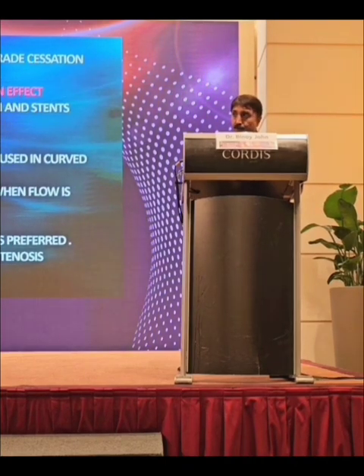accordion effect. There can be pseudo kinks, and sometimes kink transfer can also occur when you use the wires. This makes visualization and positioning of balloons and stents difficult. Coming to stent length selection, long stents are easy to use, but the problem is fresh kinks or pseudo kinks can occur in the lower segments. Short stents are ideal, but difficult to position when the flow is obstructed by pseudo kinks. For anastomotic site stenosis, balloon angioplasty is preferred, and stents are avoided as there is a high risk of restenosis.